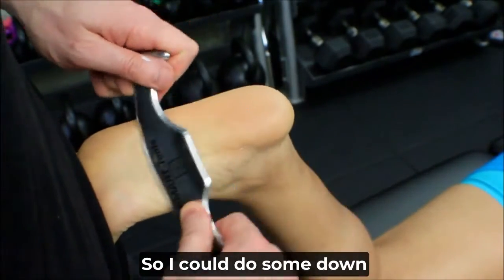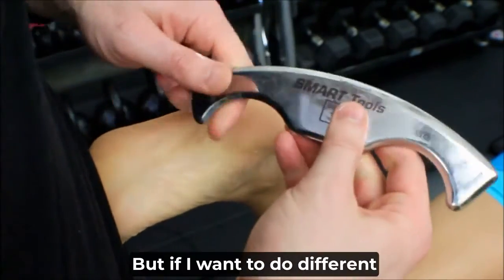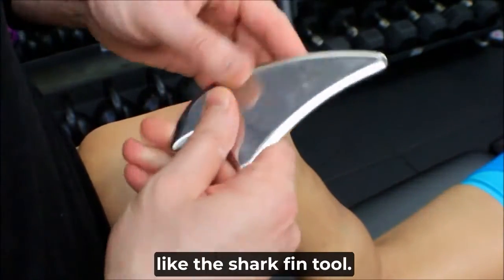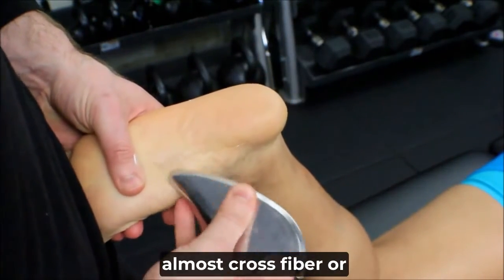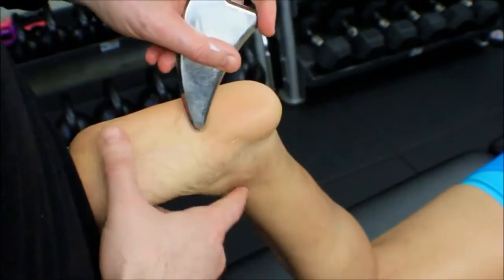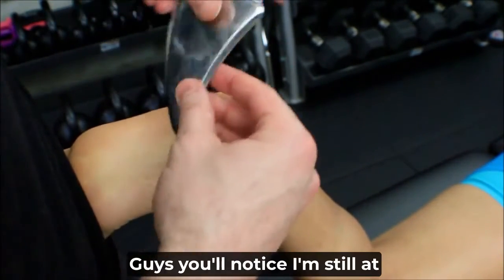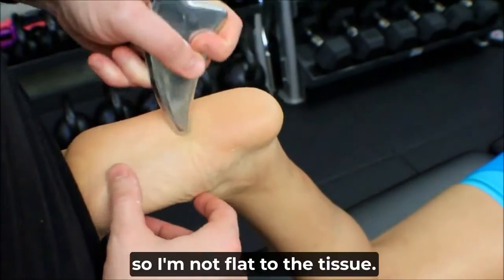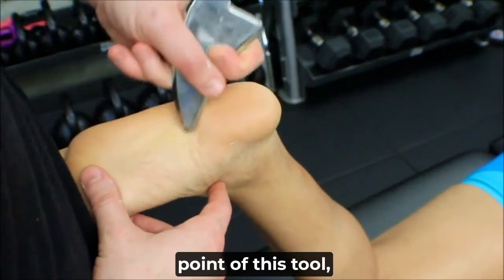So I could do some downstrokes this way, some upstrokes this way. But if I want to do different fiber directions, I'm probably going to have to use a smaller tool, like the shark fin tool. And then I can do almost cross fiber or cross friction type stuff. All right, go this way. You guys will notice I'm still at about that 30-degree angle. All right, so I'm not flat to the tissue. I want to make sure I'm dragging some tissue underneath the point of this tool.